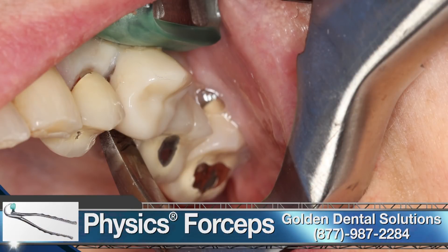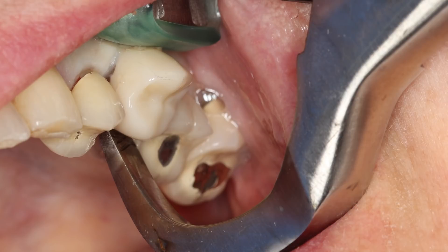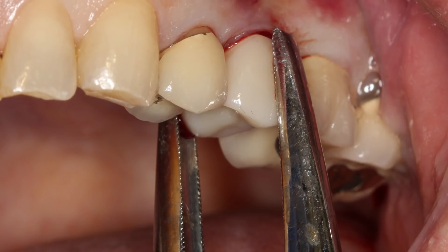Physics forceps from Golden Dental Solutions were used to atraumatically remove the bicuspid teeth. The beak, or shovel-shaped edge of the instrument, engaged the palatal surface of the root one to three millimeters subgingivally. The bumper, the second part of the instrument, was placed onto the facial aspect of the tooth to be removed as high up into the vestibule as possible. The bumper is not a working end of the instrument, but rather simply acts as a fulcrum or center of rotation for the beak. Simple wrist rotation created tension on the palatal root surface. This tension created energy resulting in a physiologic enzymatic response, breaking down the periodontal ligaments.